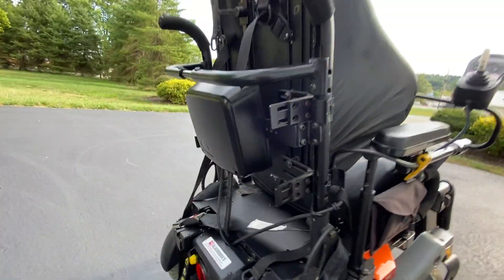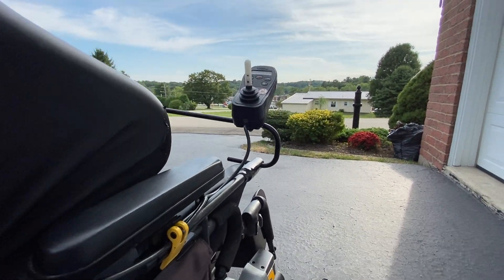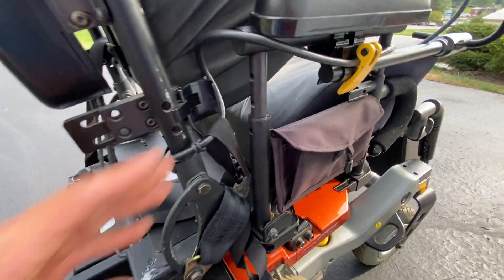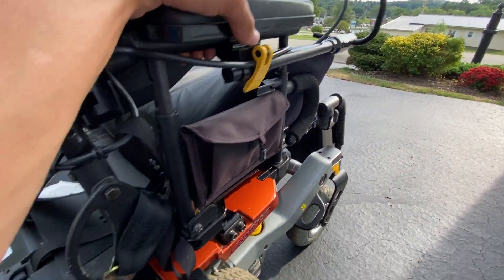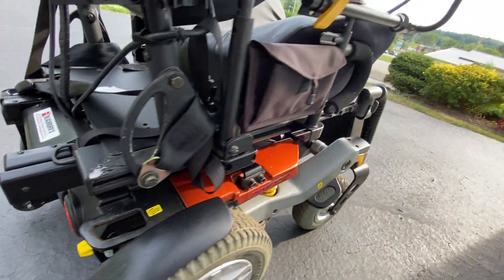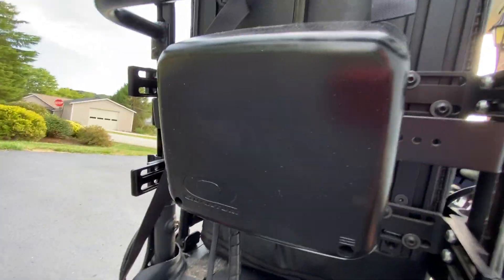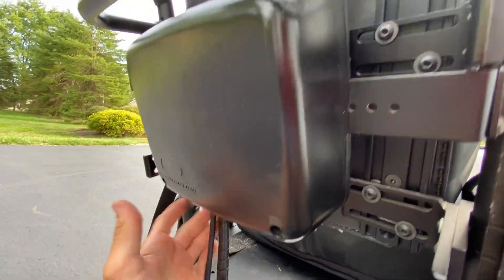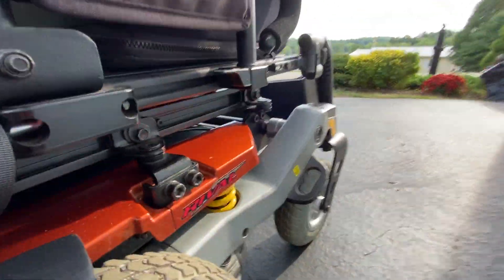Moving to the back, this does not have the Q-Logic controller, which I'm a bit bummed about. But this was more of a budget-based chair — it was probably around $2,000 to $3,000, when these things normally go for $5,000 fully loaded. You can see here where the actuator controller is and where the interface for the joystick goes in. It does have a tilt actuator, which I'll show you.